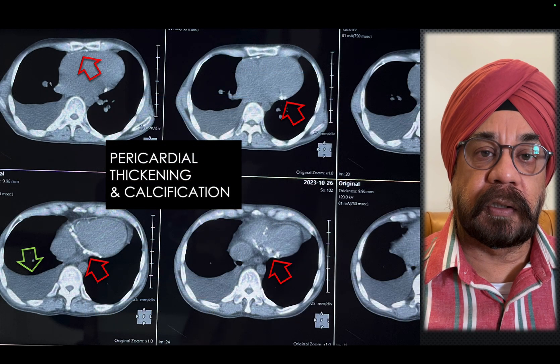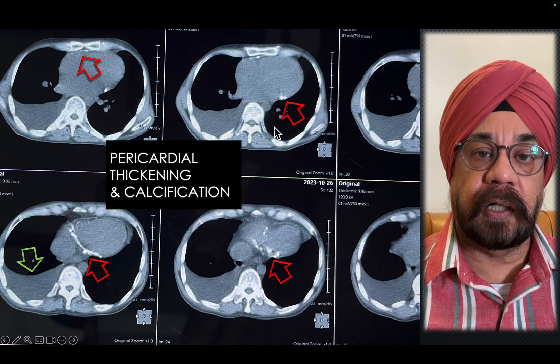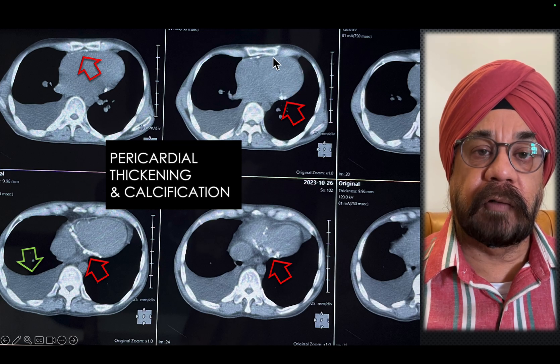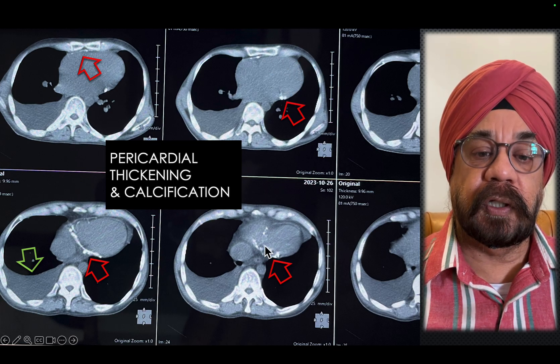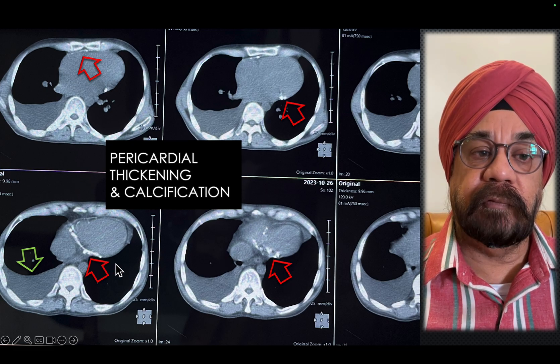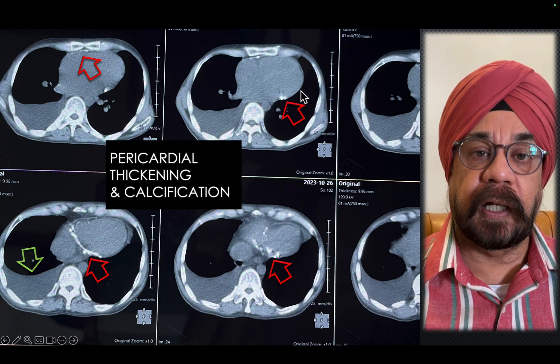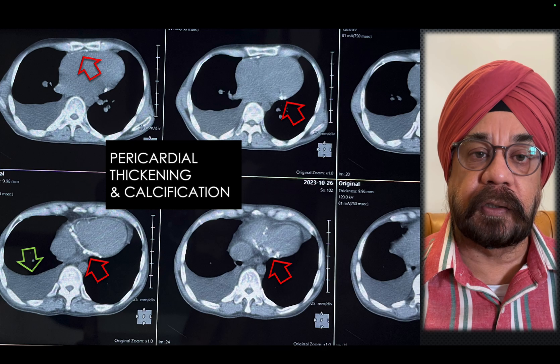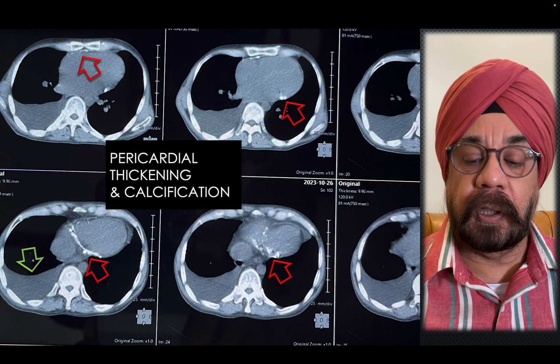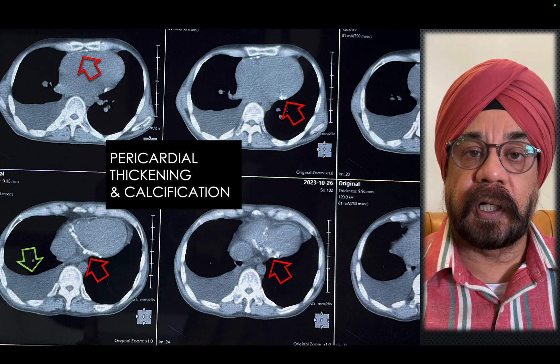A CT scan was done for pericardial thickening and calcification. You can see patchy calcification in the AV groove and anterior aspect of the pericardium, along with thickened pericardium, making the diagnosis of constrictive pericarditis and suggesting this patient for pericardiectomy.